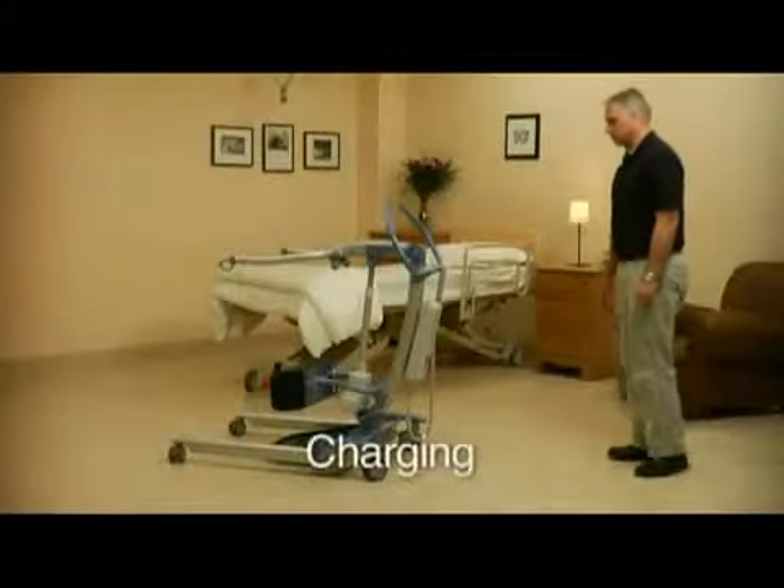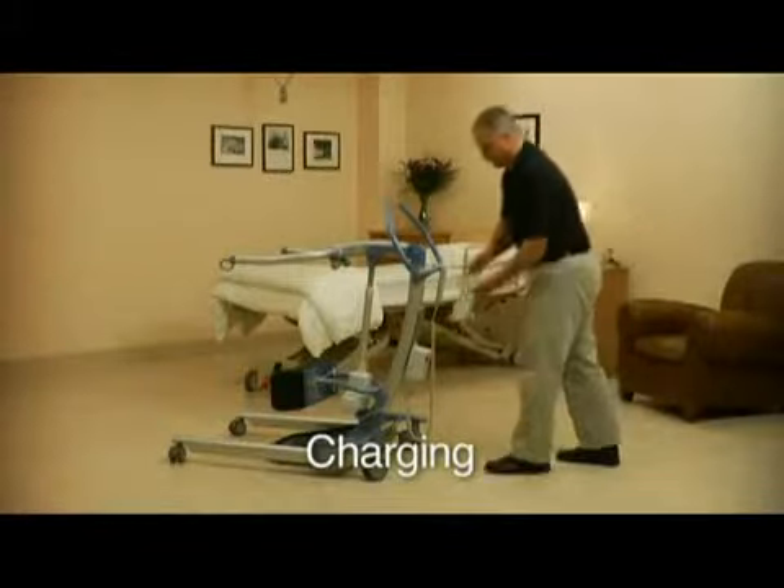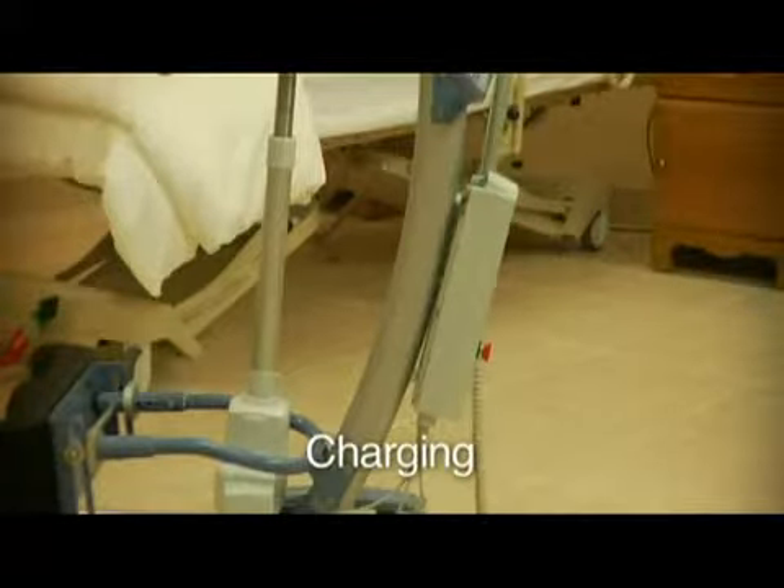When the S440's battery is low, it will beep audibly. The S440's battery pack can be removed and charged. Alternatively, the S440 can be plugged into a wall socket.